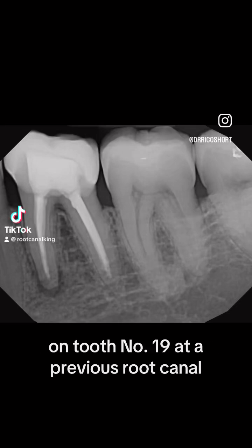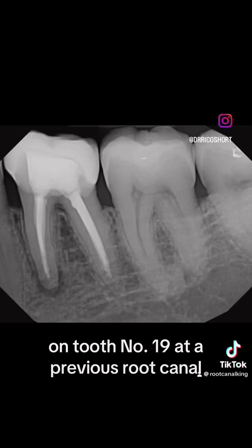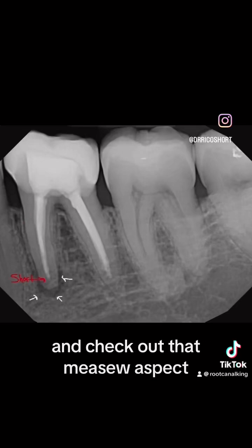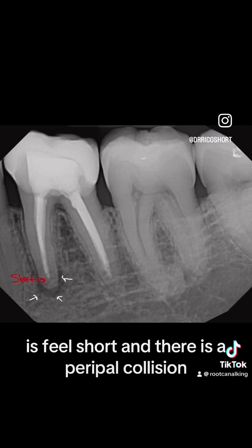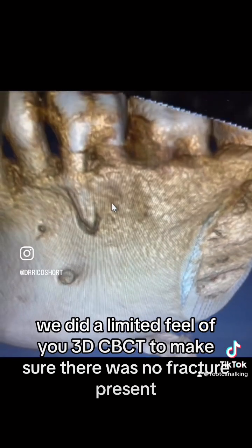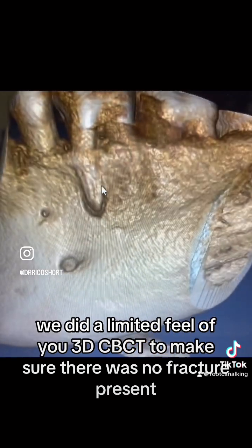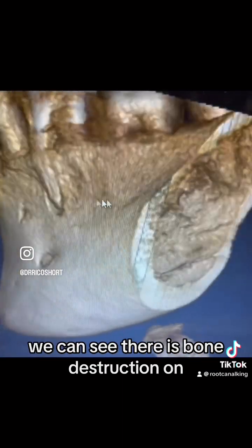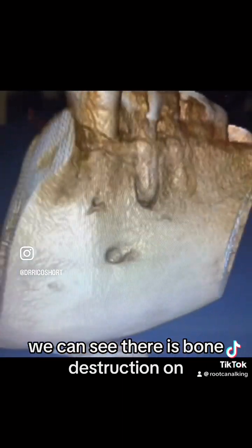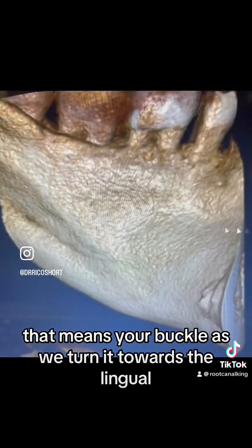This is a very interesting case on tooth number 19 with a previous root canal — check out that mesial aspect. It feels short and there is a periapical lesion. We did a limited field of view 3D CBCT to make sure there was no fracture present. We can see there is bone destruction on that mesial root, especially that mesial buccal.